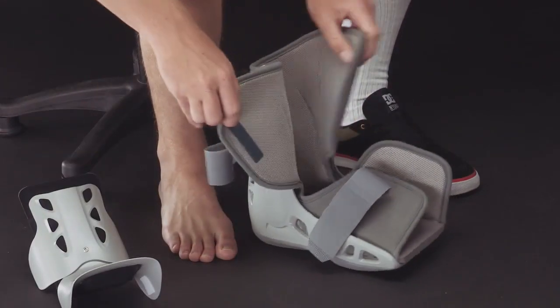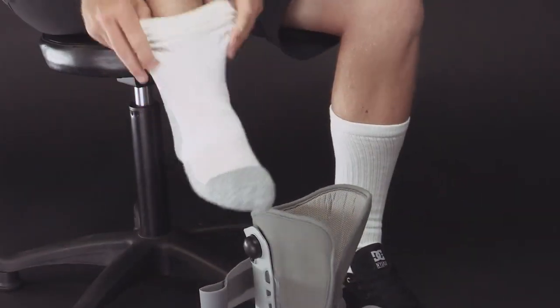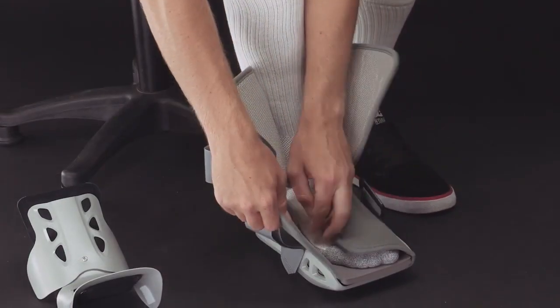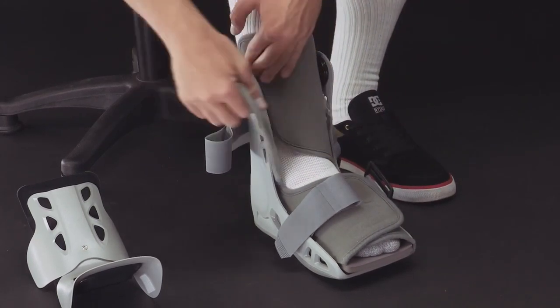Before you apply the boot, you may want to slip on a cotton or cast sock to enhance the boot's comfort. Sit in a comfortable position. Place your foot in the boot with your heel against the back of the boot. Wrap the liner around your foot, then your ankle.